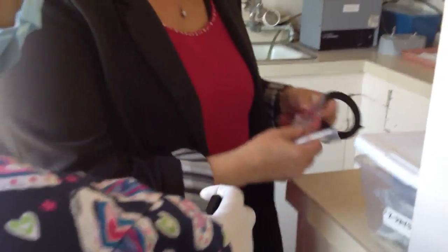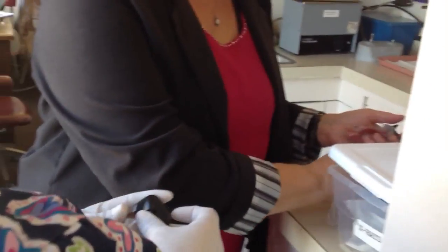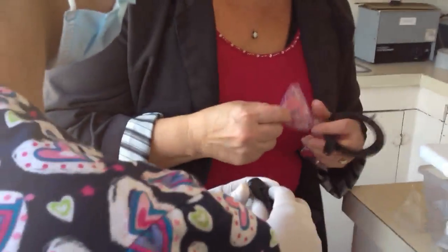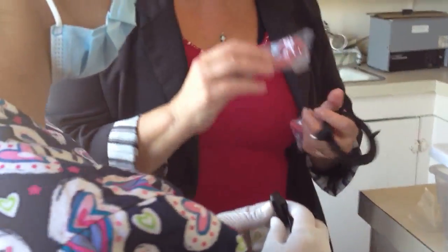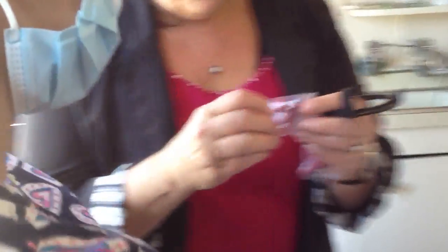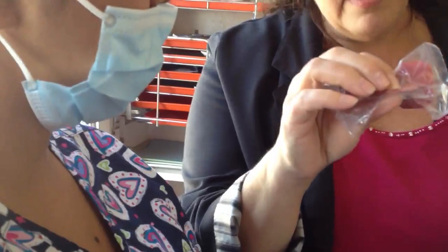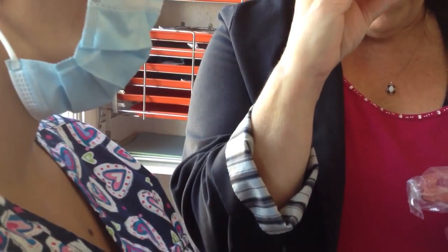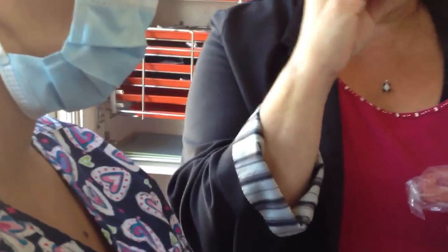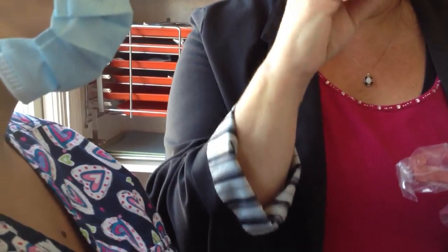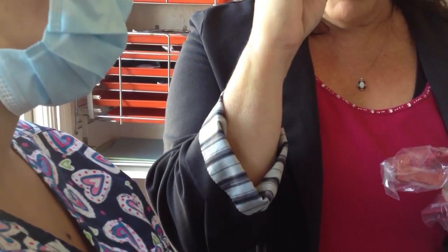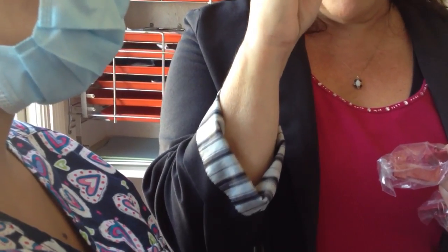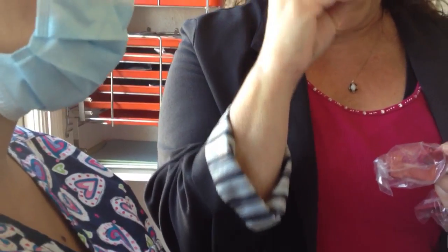Okay, one of the things that you're going to notice, doctor, is when the patient's biting on this with these, the teeth are going to be open. So in your bite wing, you'll have open teeth. You'll never have them closed together because then they're biting on the wire.